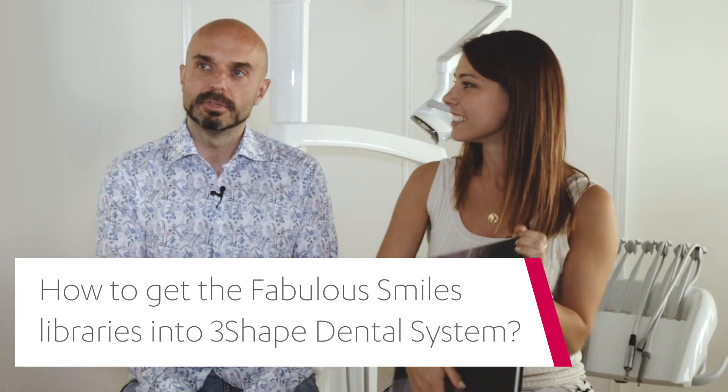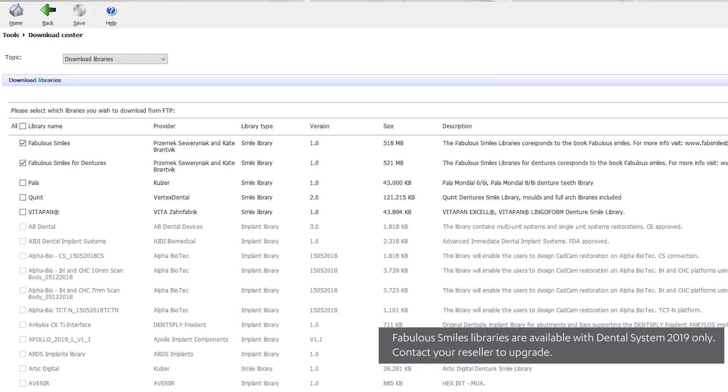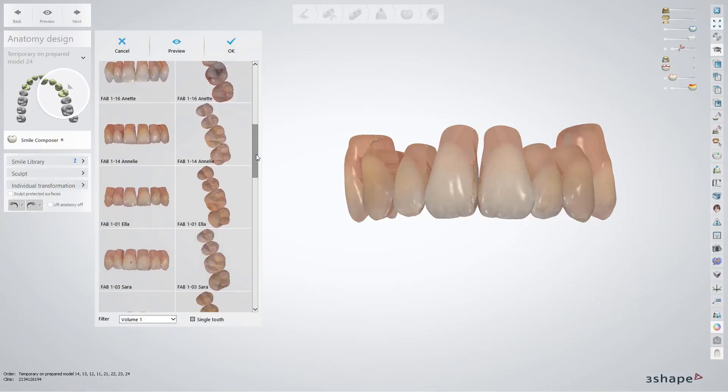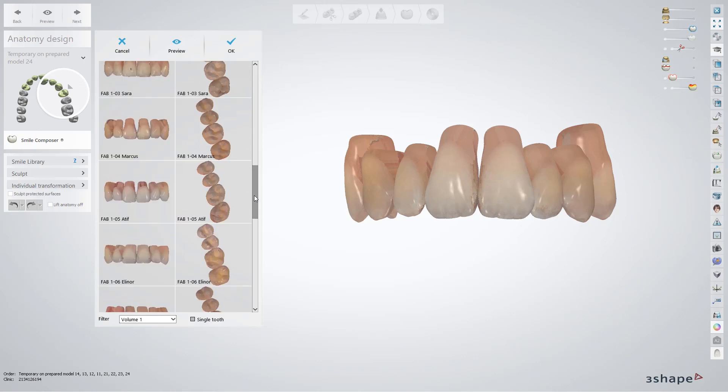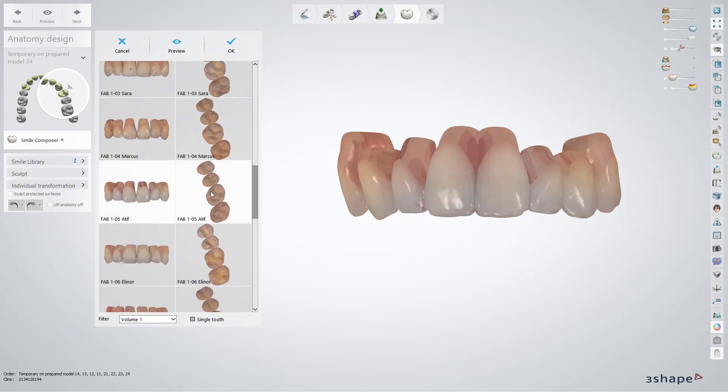You can also use the book for self-education by looking at really nice teeth and seeing how to make nice texture and shading. The libraries in the dental system are downloadable from the control center or control panel — you can search for smile libraries and choose which ones you want, such as the Fabulous Smiles libraries for Crown & Bridge or dentures, or download them at the end of installing the 2019 version.